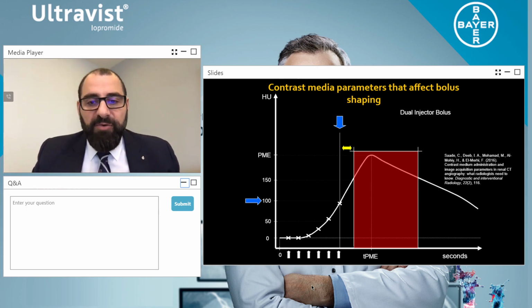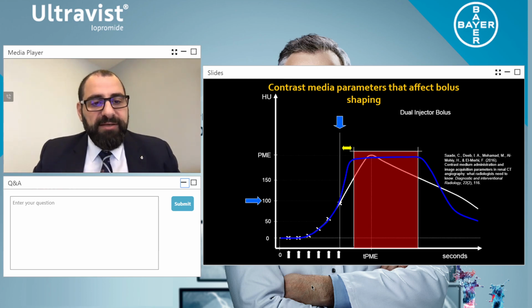So as we go along, when we give saline, what it does is, if you can see the blue line on the image, it pushes my contrast and it maintains my peak contrast enhancement. So not only is this a safety tool by using saline and the dual barrel, okay, remember you need 2 syringes here with your injector, not 1 syringe. You need 2 syringes. This saline then allows the contrast to stay at peak contrast enhancement over a longer period of time. And what happens then is it also pushes the contrast in order to distribute it equally and evenly throughout the liver.